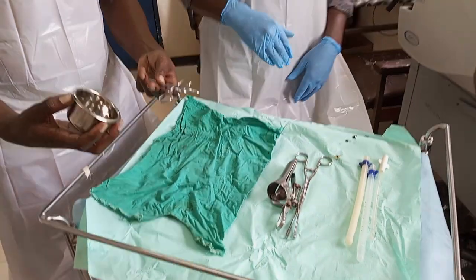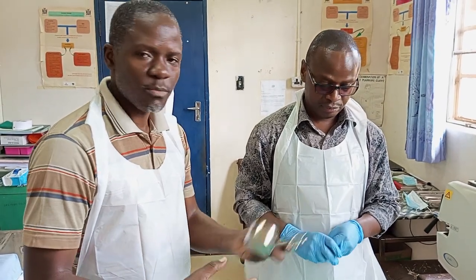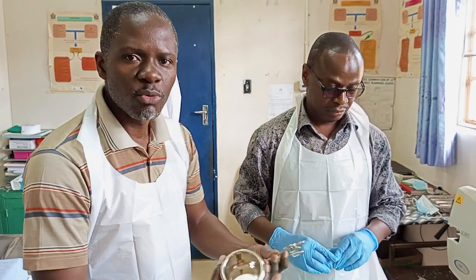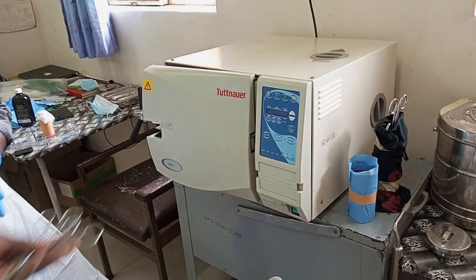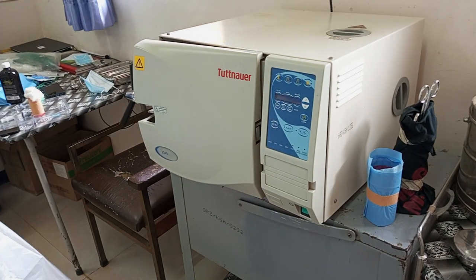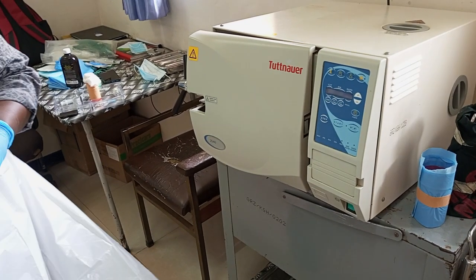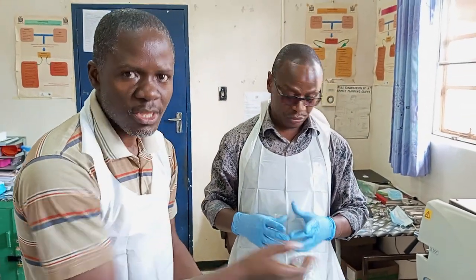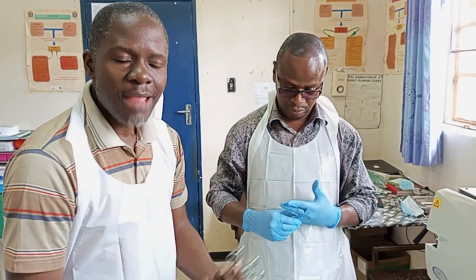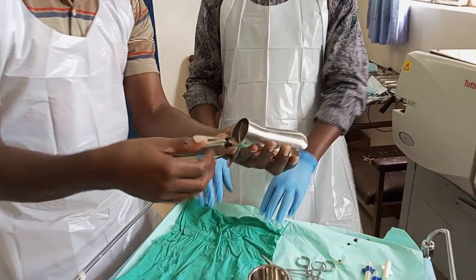From decontamination, we need to go further and make these instruments safer to be used. They need to be sterile. For these instruments to be called sterile, they need to be put into a machine we call an autoclaving machine, or sterilizer. These instruments must be put there for sterilization. Having undergone autoclaving or sterilization, that's why they are called sterile instruments.